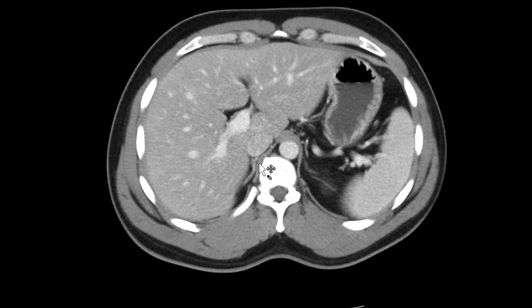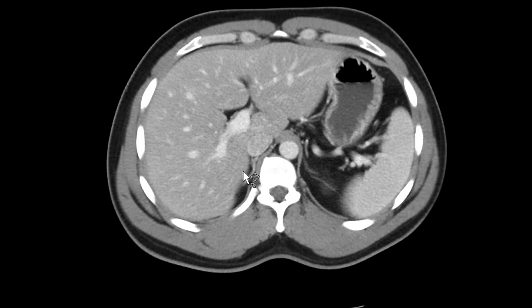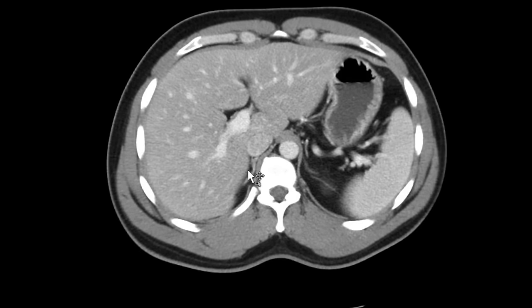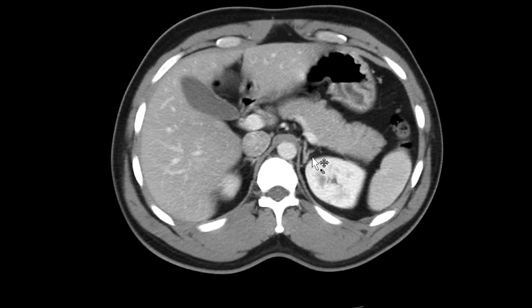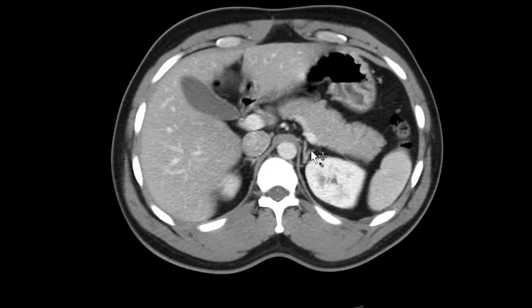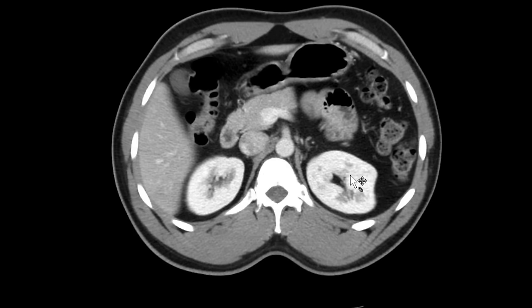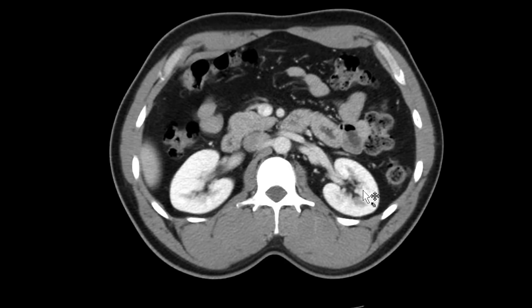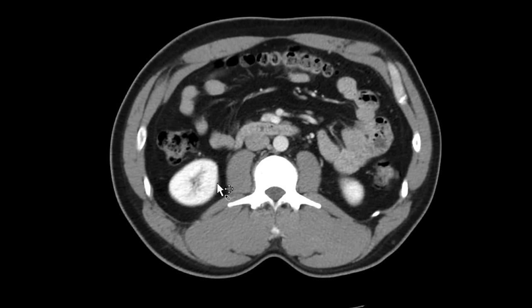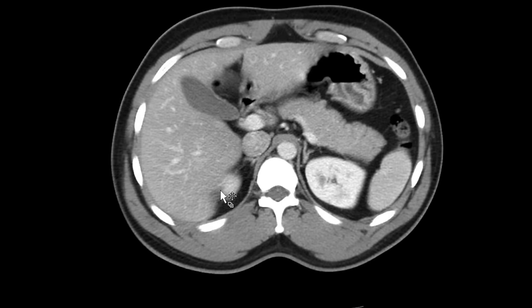Next I go through the adrenal glands — the medial and lateral limbs, if you will. The right adrenal and left adrenal gland both look good. Then I scroll through the kidneys looking for any stones, masses, cysts, etc.